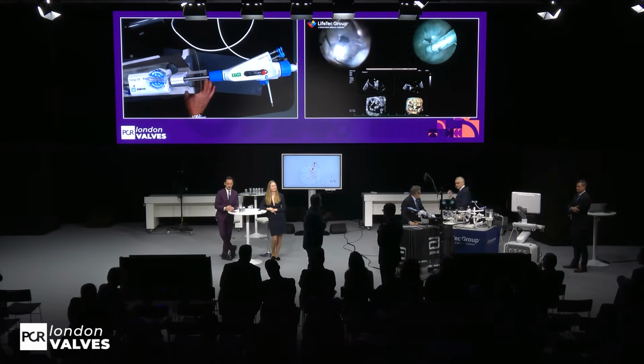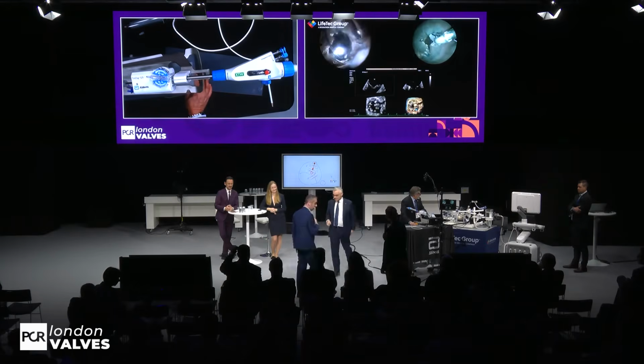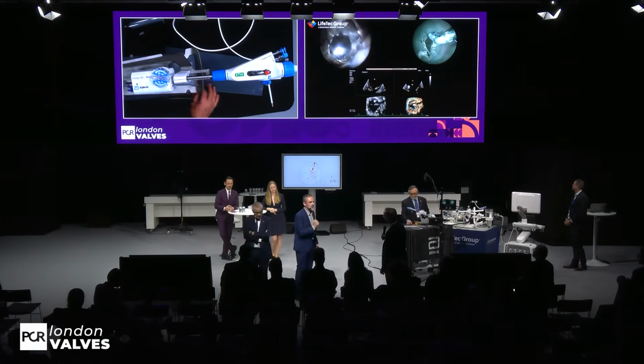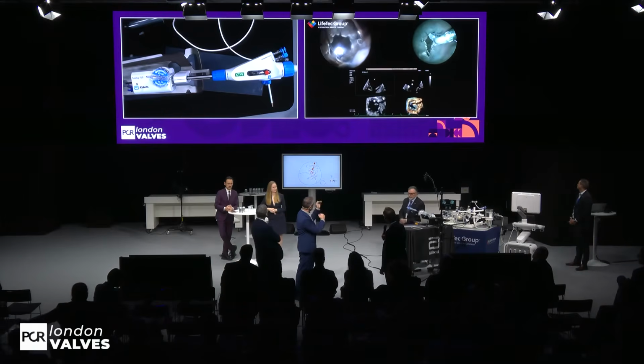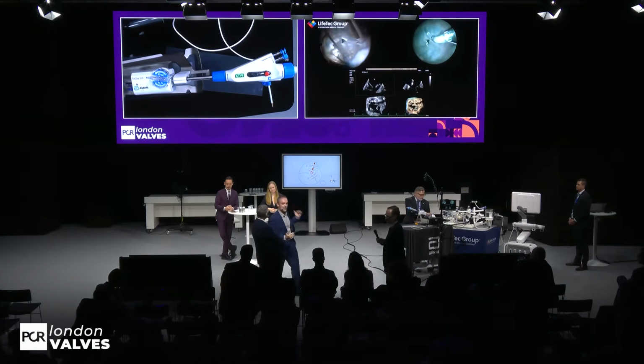Well, I don't know, because in this specific case, if I assume that it's pacemaker-induced TR, I would probably go to this position. I will try to limit it and go just to the place where the problem is. But this is open. Who would treat more anteroseptal? Raise your hands. And who would treat more posteroseptal?